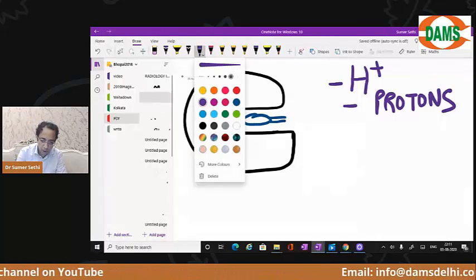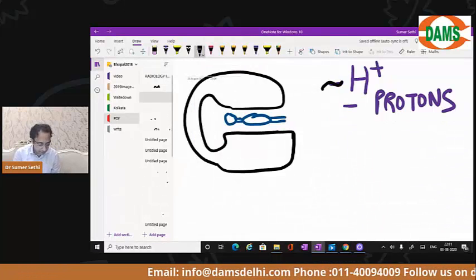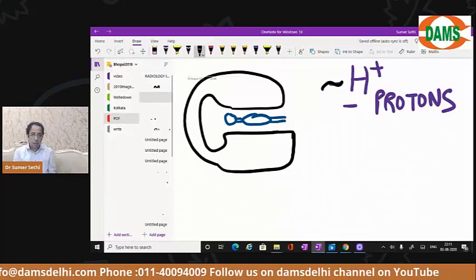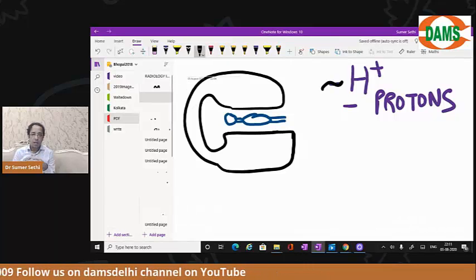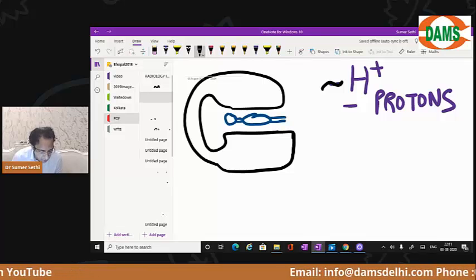So what are hydrogen ions? Hydrogen ions are tiny magnets that are present in our body. Listen to me, everybody. Now I'm telling you today that I have thousands and thousands of magnets inside my body, which are called hydrogen ions.